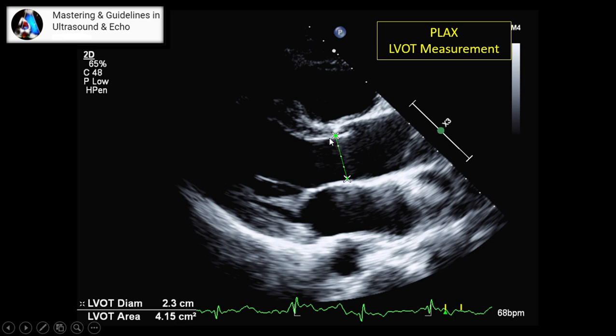It should be the same because that area is almost rectangular, and for many other reasons, as I discussed in aortic stenosis, the best spot is 3 millimeters close to the aortic root. Our measurement should be done at mid-systole, or the time that gives us the maximum diameter. The highest diameter will be taken as the LVOT diameter.